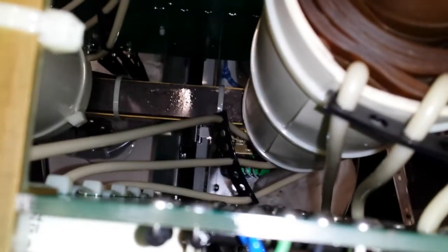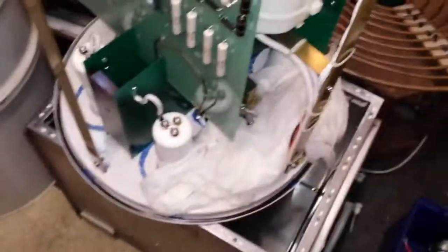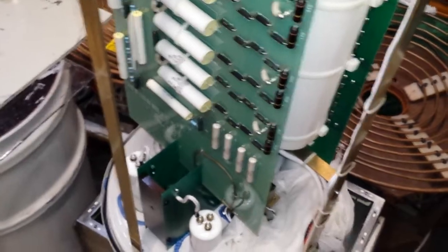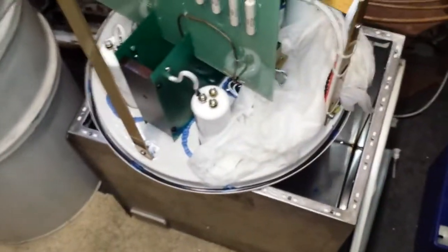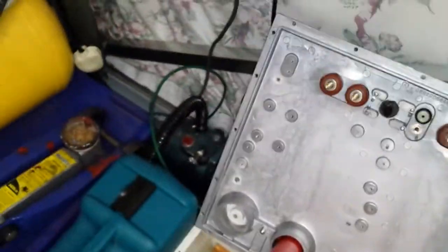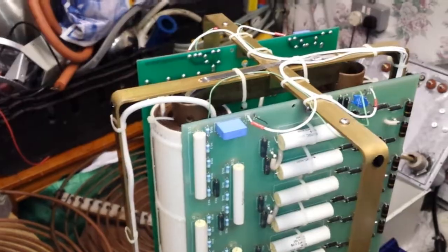Bloody noisy dog. You can just see that down there. It's pretty cool. I do like it. It's very nice indeed. I don't think I'll be stripping that, to be honest with you. I might leave it as it is to look at when you come in, or just plonk it back inside the container, fill it back with oil and stick it in another vacuum, because there's a vacuum port on the top there. I can get the hose on for my vacuum machine, which is down there, and vacuum that thing up and leave it on for quite a few days, because I do like it.